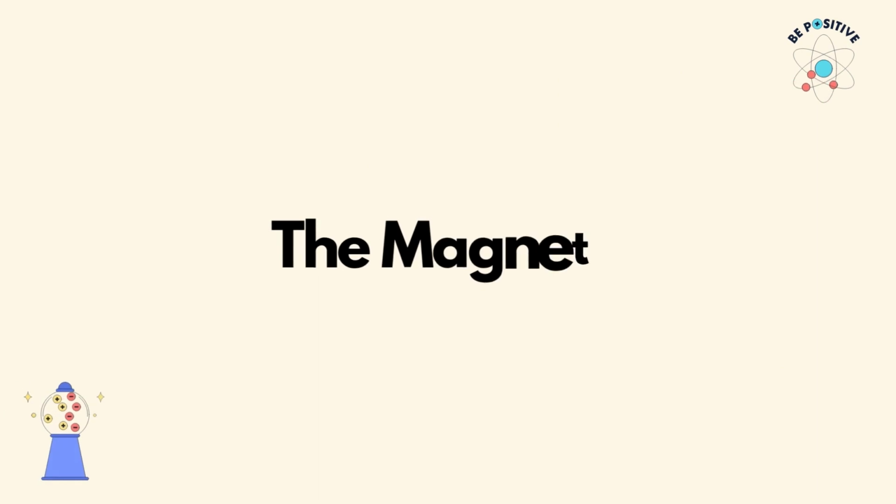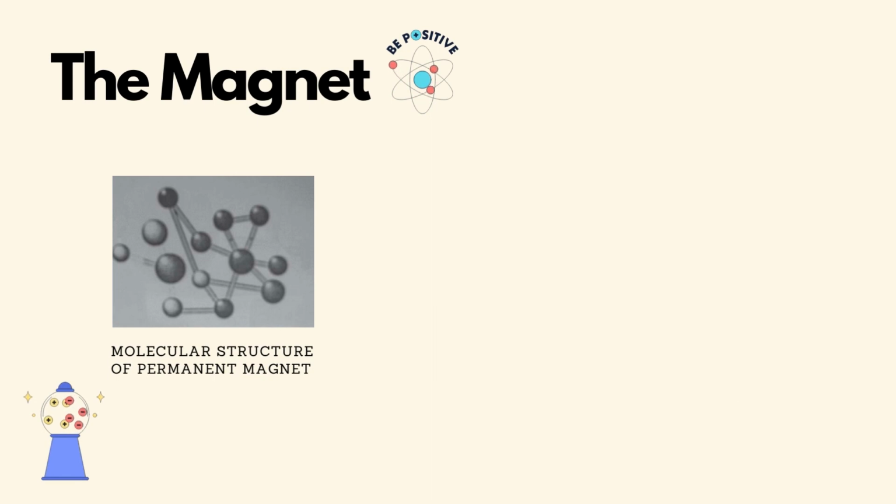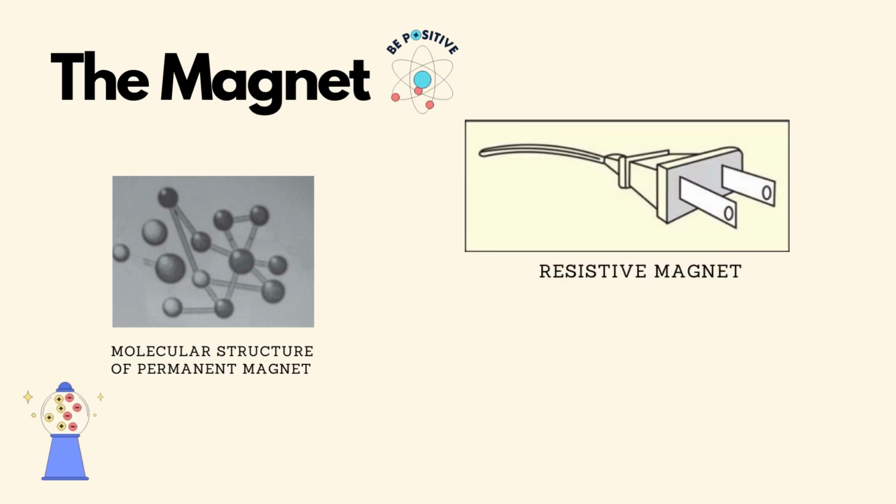The main component of MRI is, of course, the magnet. This is the most important and expensive component of the MRI system, which is available in three types. Permanent magnets. Though simple and cheap to run, they are still extremely heavy and do not generate high fields. Resistive systems. These are electromagnets wherein the magnetic field is generated by an electric current flowing through a coil. They have two major drawbacks, which are high electric and water consumption for cooling.